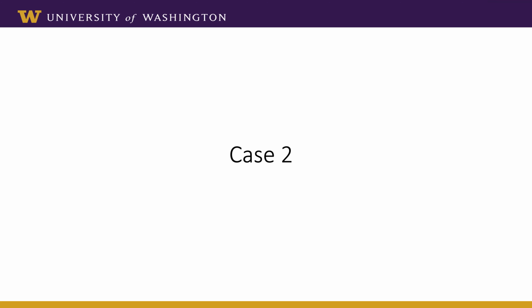But no, I think the factor is your case planning. So in that one, I was thinking we're going to try to just do a 1.75 burr, split the difference and be done. But if I'm worried, we were going to use a bigger burr because that's what we had that day. Some of it is just about your strategies.